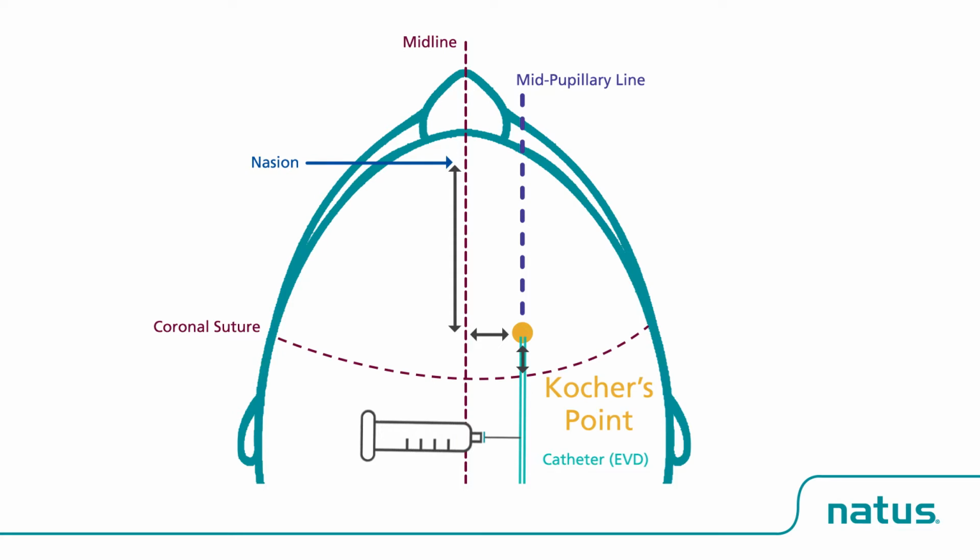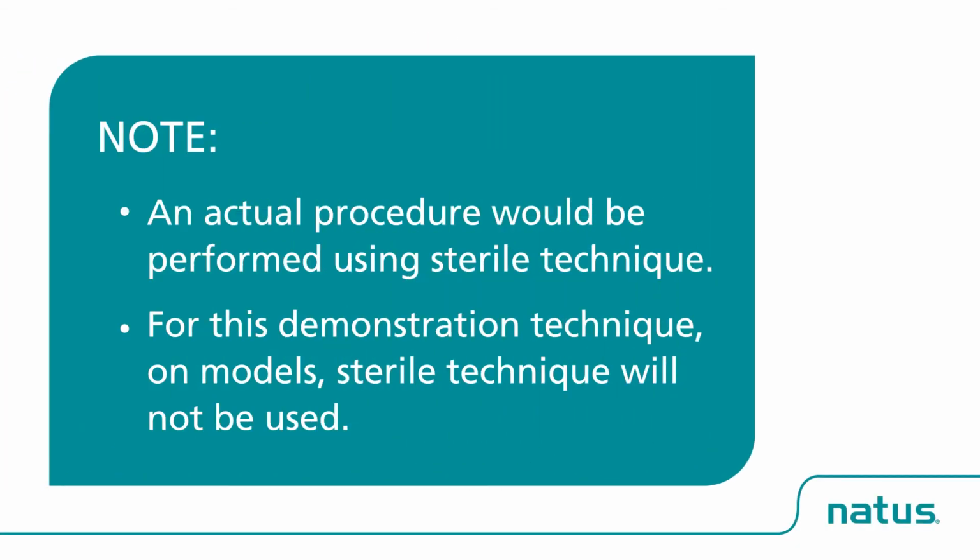Open up the cranial access kit using sterile technique. This will be the sterile field where other supplies such as the ventricular catheter will be dropped. Note: an actual procedure would be performed observing sterile technique. For this demonstration video on models, sterile technique will not be used.